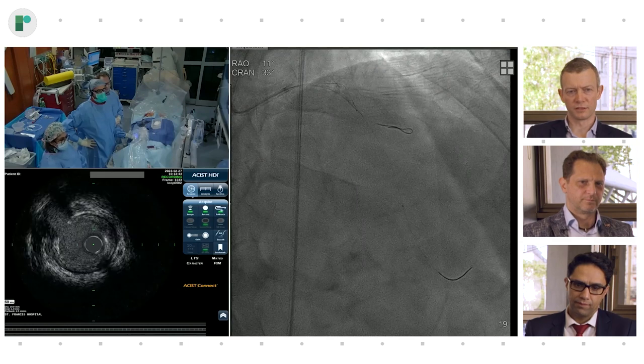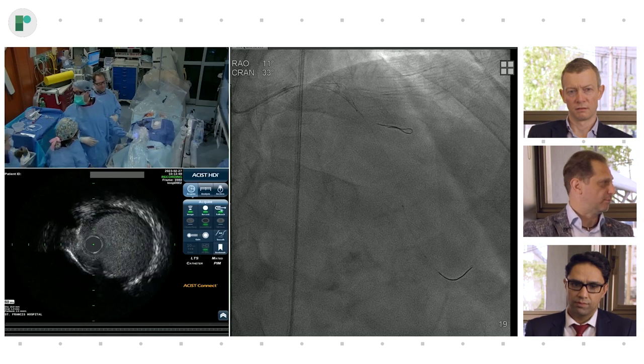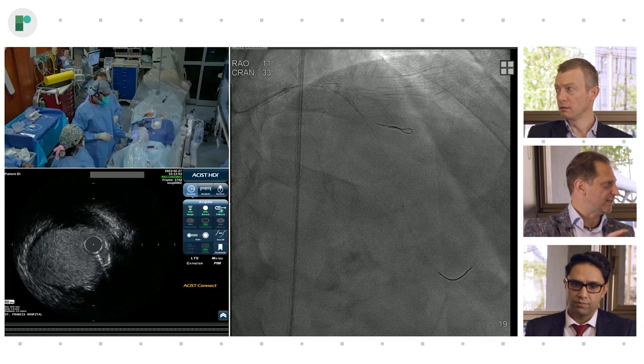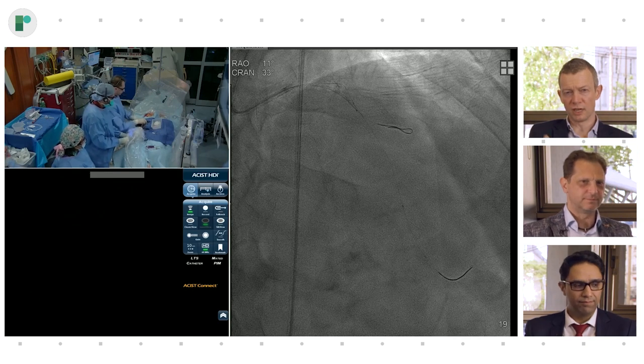Here it's difficult, right? It seems really a lot of device. And I bet you we didn't actually repeat the FFR after dilatation. But I bet you if we would have, it would have shown that now the tight lesion might not be as much pressure loss there, and then there's pressure loss elsewhere in the vessel. So you see how fast this goes, right?